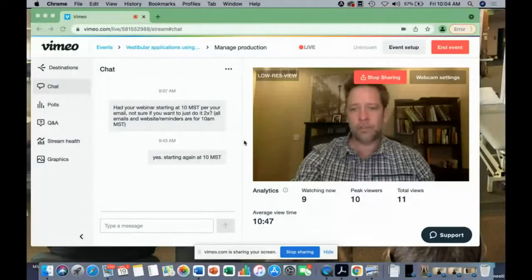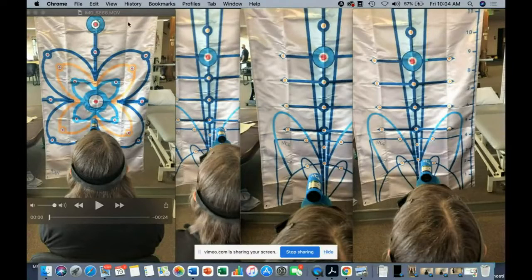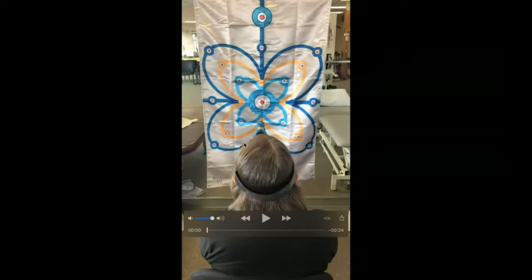All right, so let me share my screen here, and we'll go through the entire screen here so you can see everything. So let me get rid of this. Okay, so let's take a look at this first video here with her. And this is shared with permission, of course.